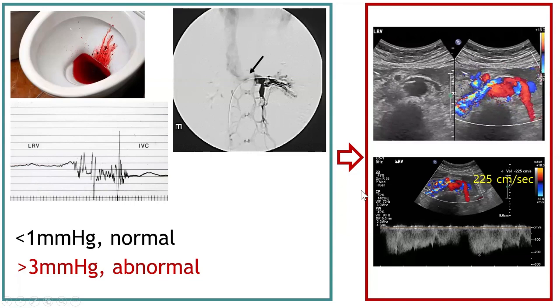But nowadays, we can use Doppler ultrasound, grayscale ultrasound. We can see the compression on image, and with color Doppler ultrasound, we can see the hemodynamics in these vessels, slow flow here and fast flow here. And we can measure actual flow velocity in these fast flow areas. And in this patient, it was higher than 200 centimeter per second.